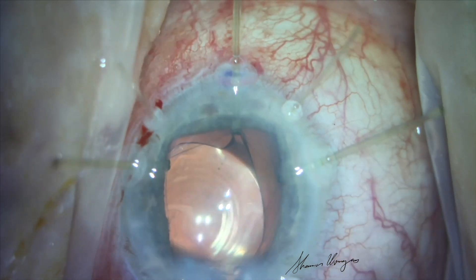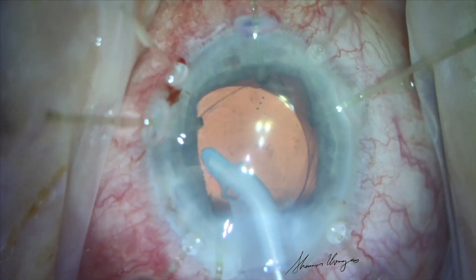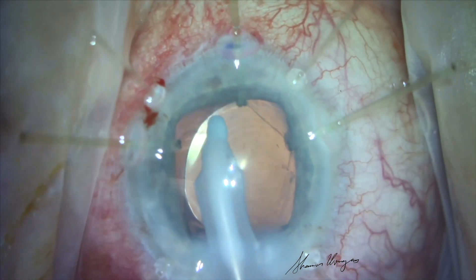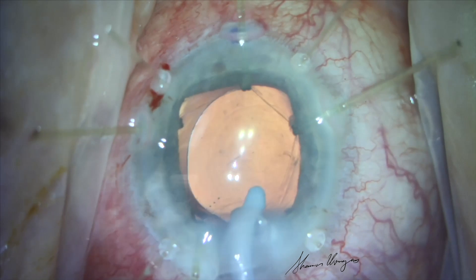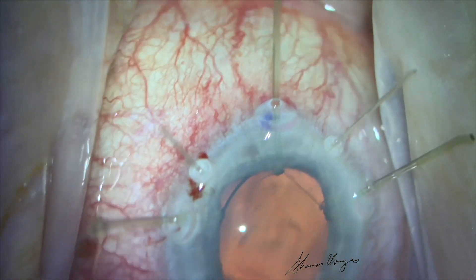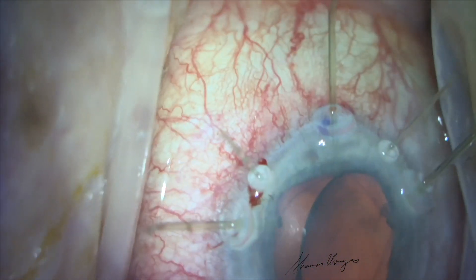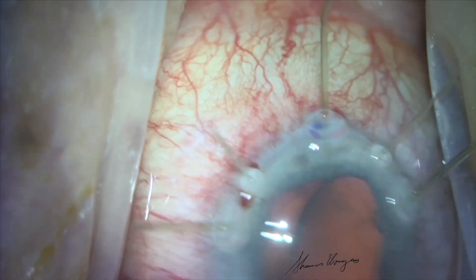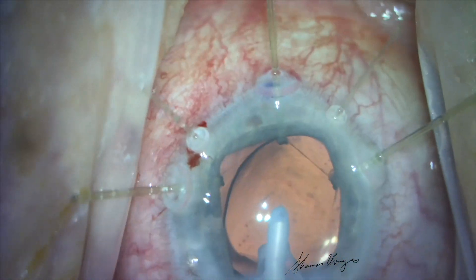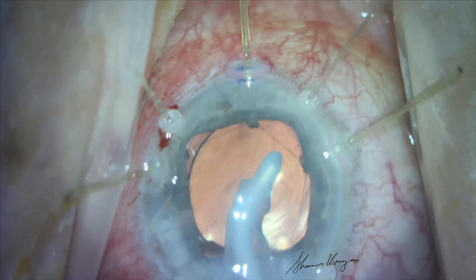Rotation is performed carefully and methodically. But the patient again suddenly moves enough that the IA handpiece comes out of the eye, causing collapse of the anterior chamber and likely an anterior capsule extension, which extends to the zonules.